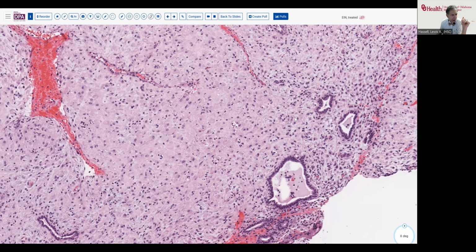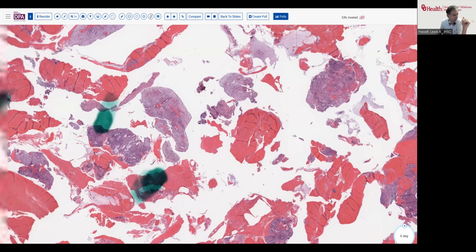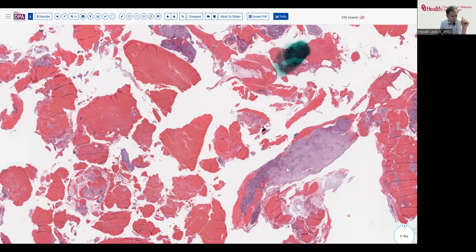And so the things that don't look like that should stand out. So things like this, we should examine carefully. Things like this that's been dotted. Here's another fragment over here that's been dotted. Those look different than the other tissues like this, which have a more normal pattern.